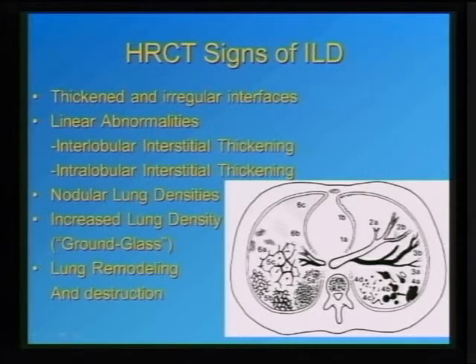The same thing here, you have this sawtooth appearance along the bronchovascular bundle. And that's especially in patients that have abnormal pulmonary function tests and normal chest X-ray. The CAT scan may depict those findings that can be a sign of fixed and early interstitial lung disease.